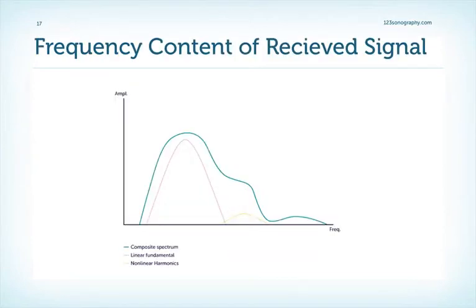Now I just briefly have to go back to the physics of ultrasound again. Remember I told you we're sending out a signal which has a certain frequency, and that pulse wave is reflected. What I haven't discussed yet is what the frequency of the return signal is. Well, the basic frequency of the return signal is the same as the one that is sent out, but not entirely. Take a look at this curve here.